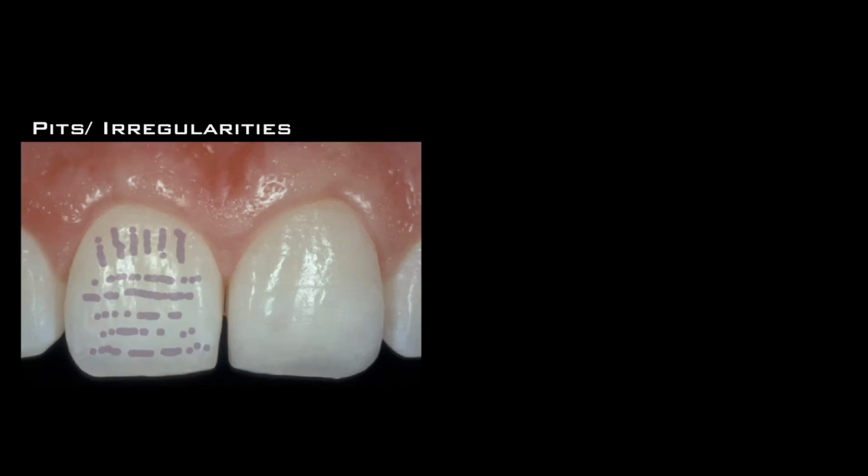And then the third part to what Aki talked about is the pits and irregularities. Sometimes you'll just see me with a burr tapping away at a tooth to create some of these little pits and irregularities. I'm not really following any scheme except to mess up the surface a little bit.